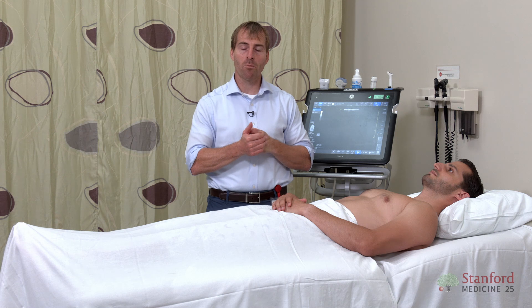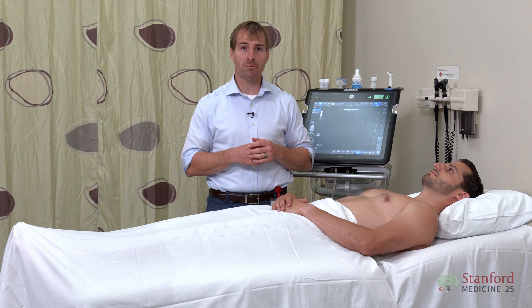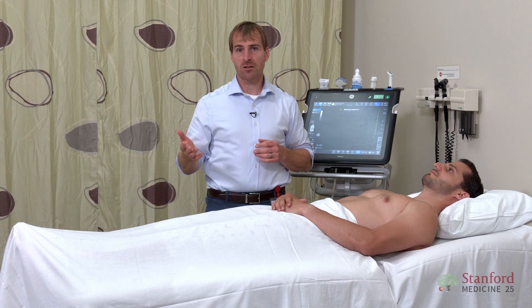We'll start with pneumothorax. As a hospitalist, I don't diagnose a lot of pneumothoraces — my colleagues down in the ED are usually checking this out more than I am. But it can be useful, especially after performing a procedure where pneumothorax is possible. Using ultrasound to look for pneumothorax is really nice because it's quick and has a very high negative predictive value. The sensitivity is such that you well outperform a chest X-ray and approach a CT scan in terms of negative predictive value.